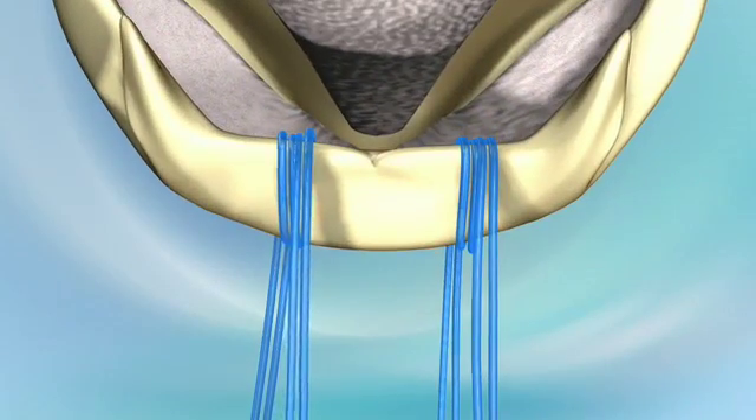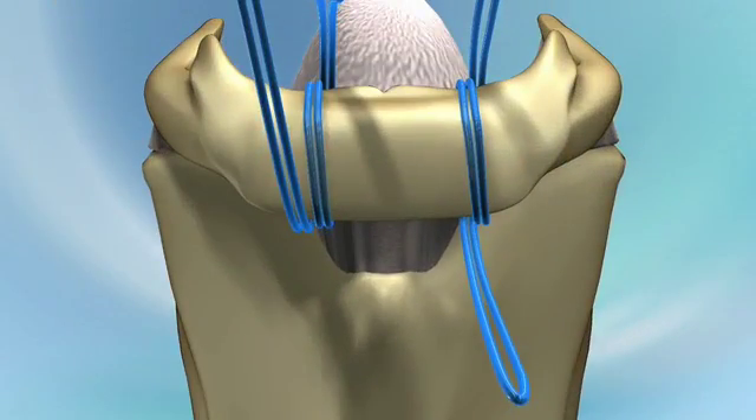The suture tails now oppose each other — one above the hyoid, one beneath. A surgeon's knot is placed on the midline.